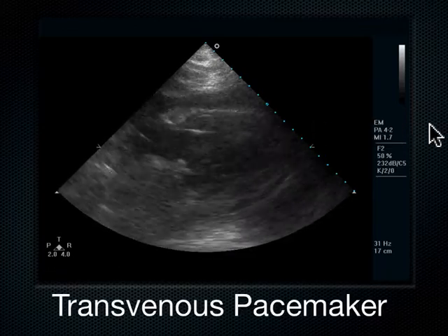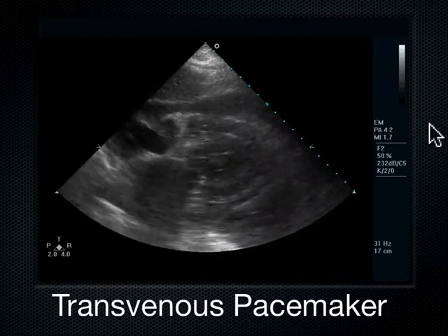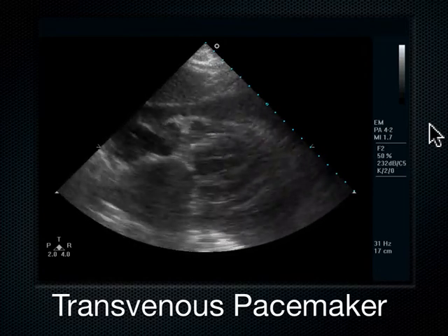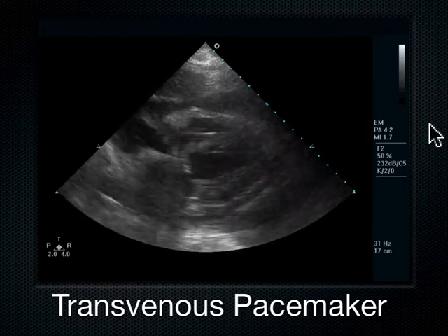So that's what a transvenous pacemaker looks like. It's just something to consider if you're in the heat of the battle and you're trying to float this transvenous pacemaker somewhere, wherever you are. Think about looking at it under ultrasound guidance so you can turn it and guide it to get it in that spot. Those pacing wires make very good reflectors of ultrasound.